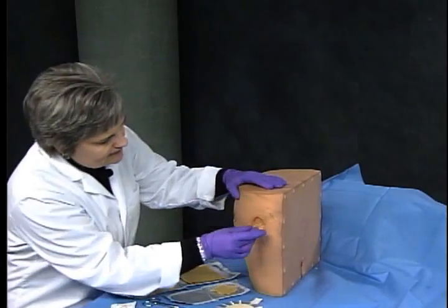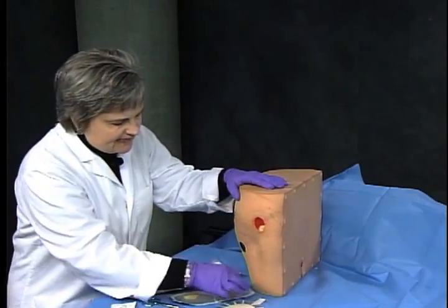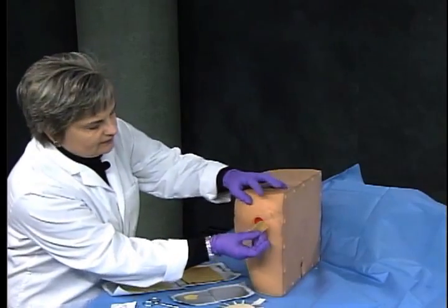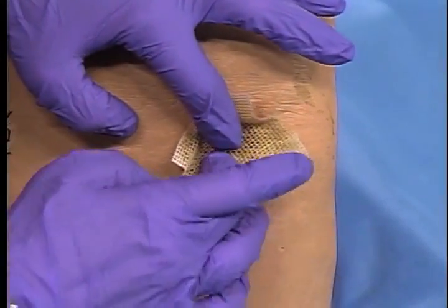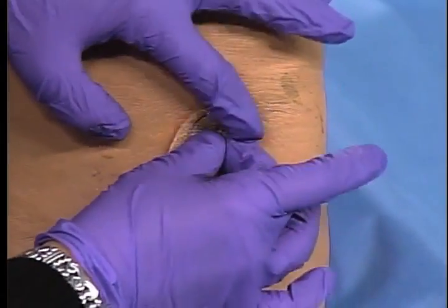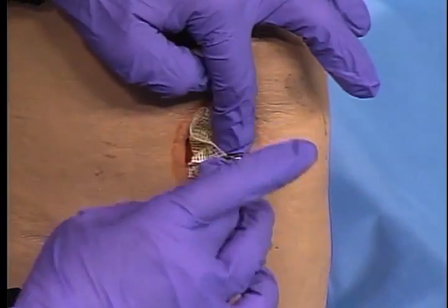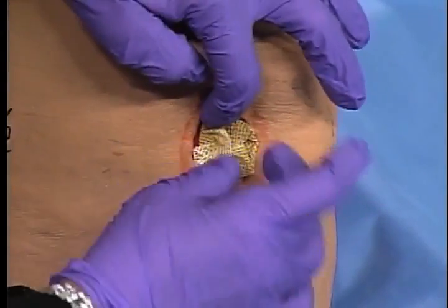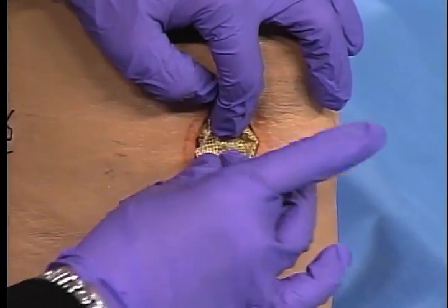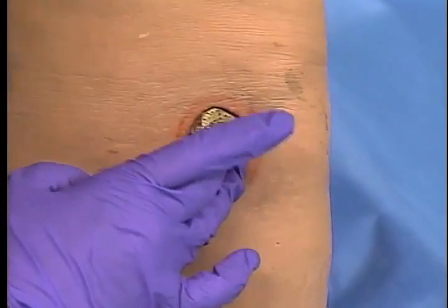I forgot my scissors. Let's just take this piece out, put that here, and say I've chosen a 2x2 size for this wound, but I don't have scissors. I don't have an ability to cut it. You can just, again, place the dressing into the wound, and then what you do is you just fold in the edges, okay? Just gently, again, just tuck them in so it covers the entire wound base. You want the dressing to be in contact with all the surfaces of the wound, okay, in order to come in good contact with that wound bed, all right?